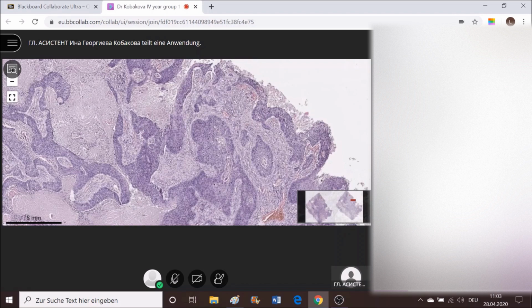If you have in mind that highly differentiated squamous cell carcinomas are considered to produce keratin and to be forming nests, and poorly differentiated squamous cell carcinomas never form keratin pearls and sometimes look more solid, as a deposition of cells without formation of nests.